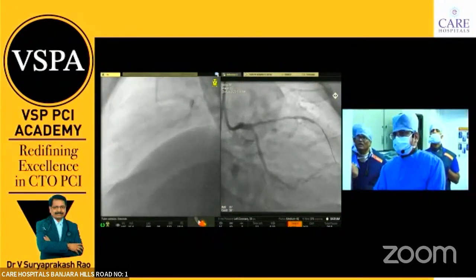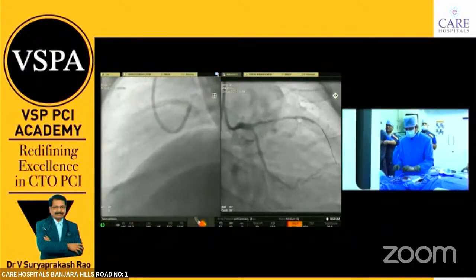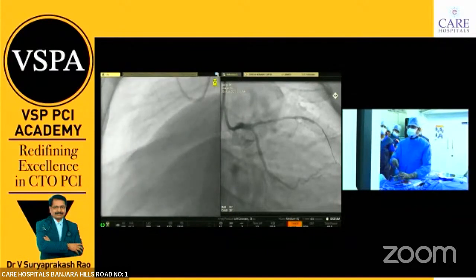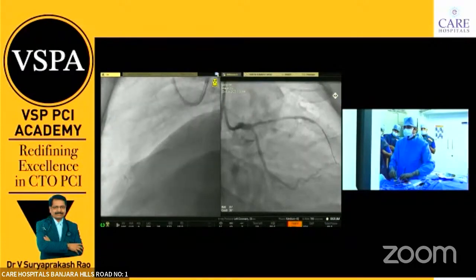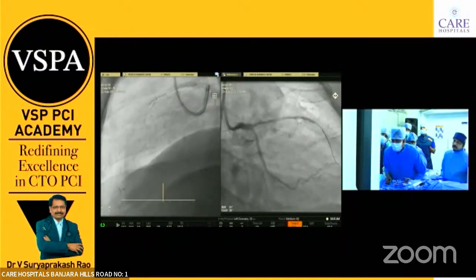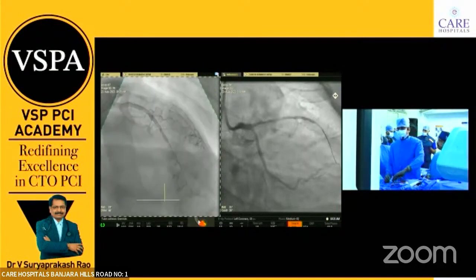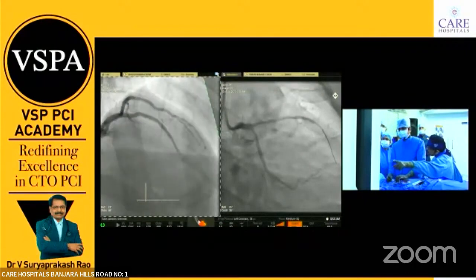Focus that white one. Put the leads. No, wait. Please wait. We use distal leads, we want to see. Let him put everything, sir. Leads and all. Okay. Because the white thing you cannot. This is AP, yeah? This view, last view. This view area. And this same thing AP.